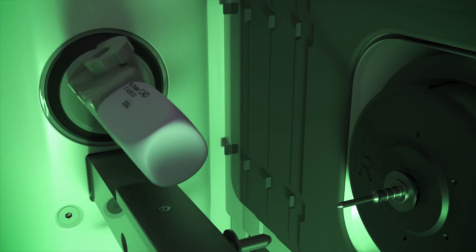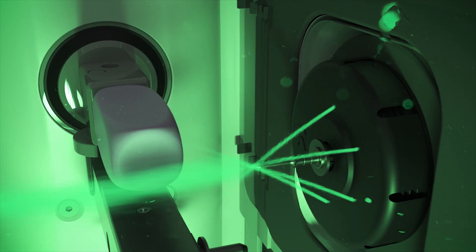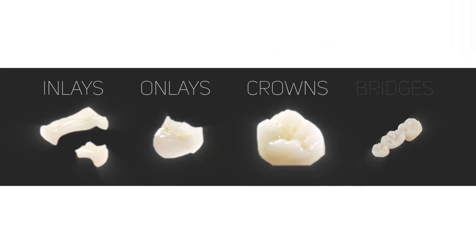Reaching maximum speeds of 100,000 RPMs, a 4-axis high-speed spindle is ideal for single-visit restorations and everyday milling of inlays, onlays, crowns or bridges.